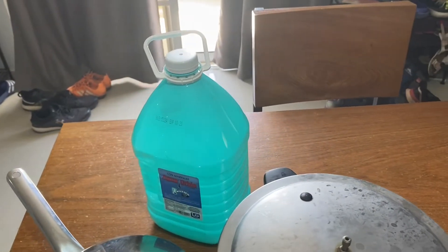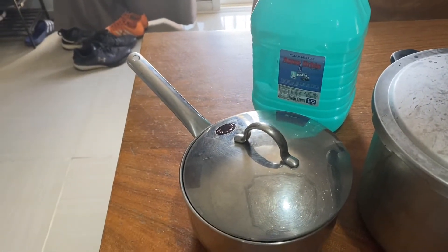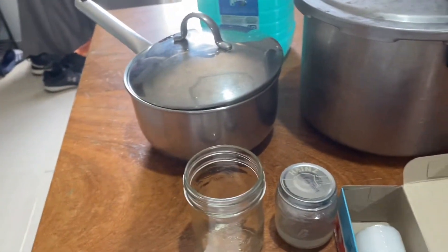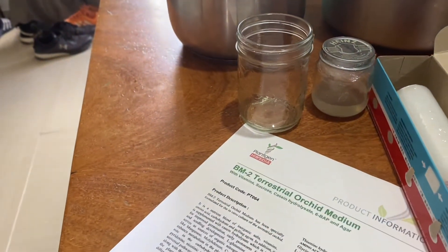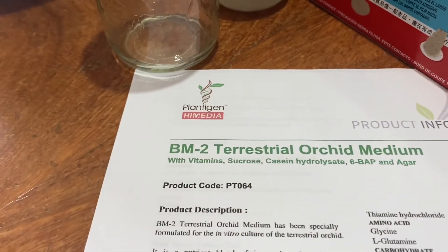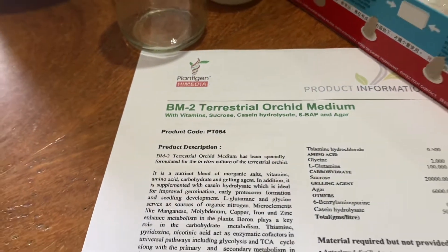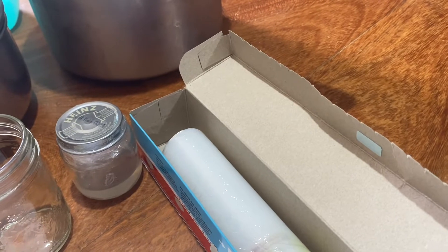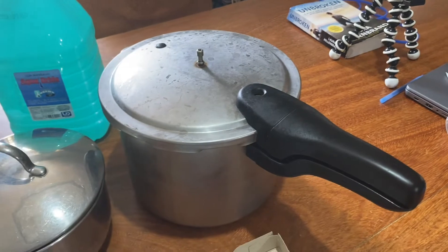The things I needed for this project were some distilled water, a pot to make the mixture in, some glass jars for the flasking later, instructions from the medium that I bought — I used PT 064 from High Media — a little bit of saran wrap to seal the lids, and a pressure cooker for sterilization.